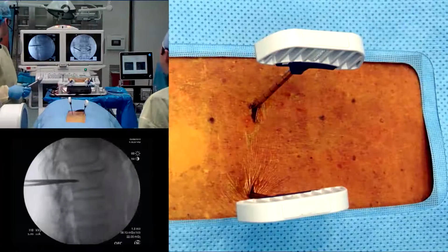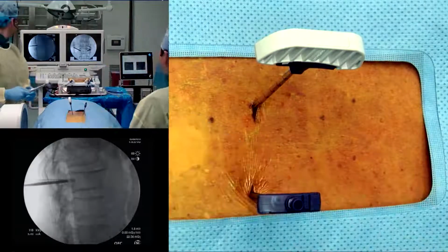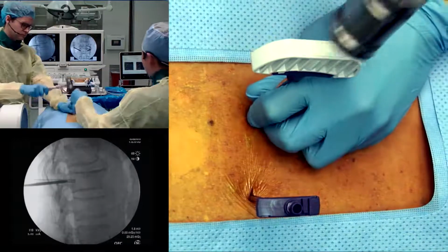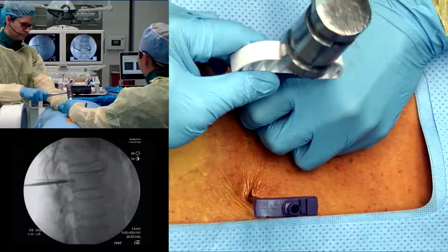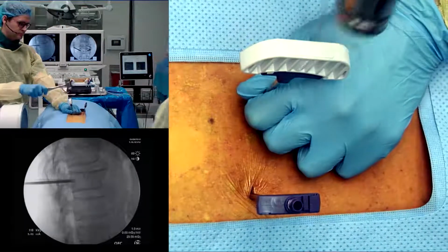Picture that. Good. And then we're going to take out the inner trochar. Picture that. So that's me. And you need to go in a little bit deeper. And then I would head caudally also. Picture. That looks great. So just go in just a little bit more. Yeah.